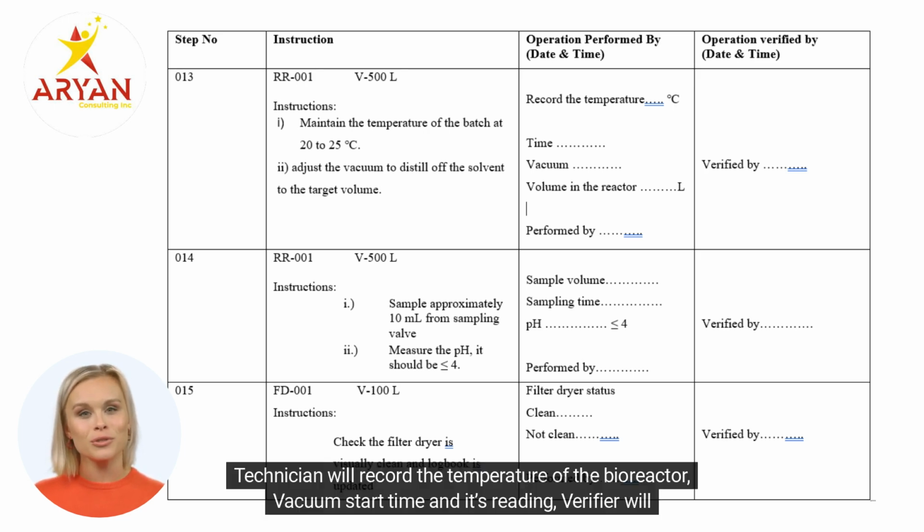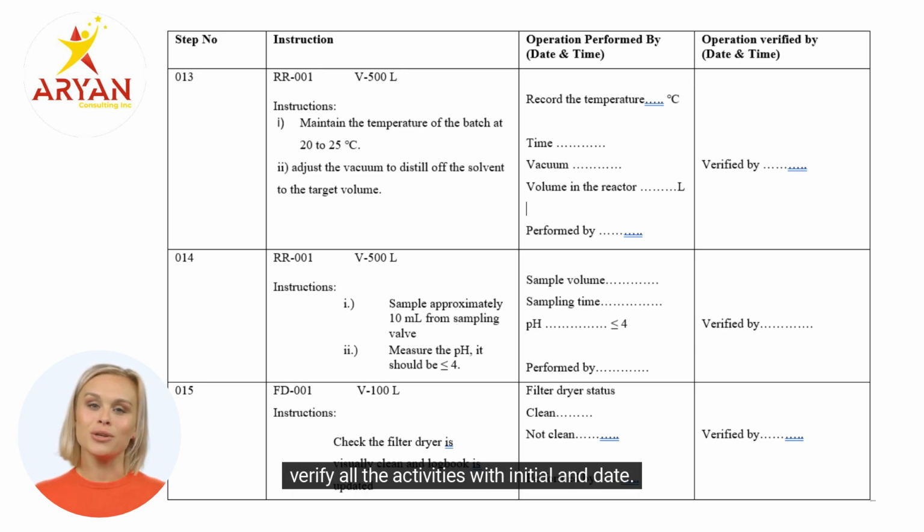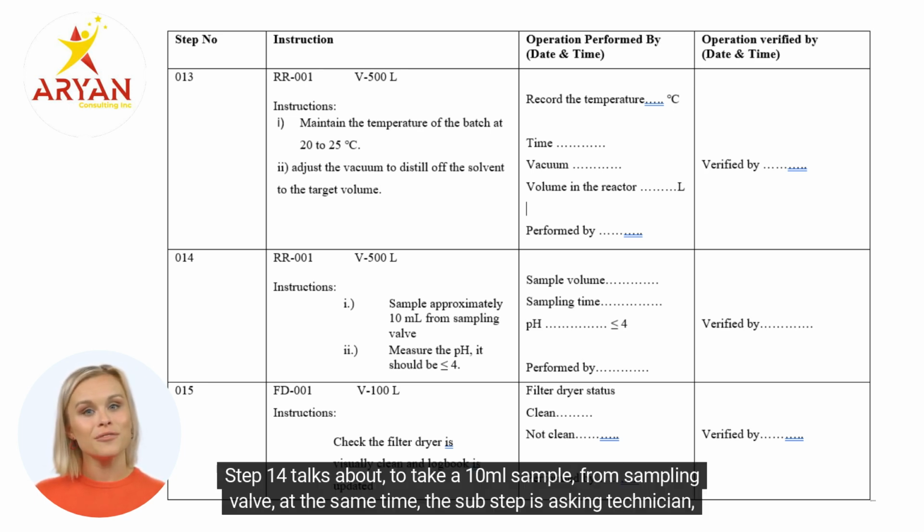Technician will record the temperature of the bioreactor, vacuum start time and its reading. Verifier will verify all the activities with initial and date. Step 14 talks about taking a 10 ml sample from the sampling valve at the same time.